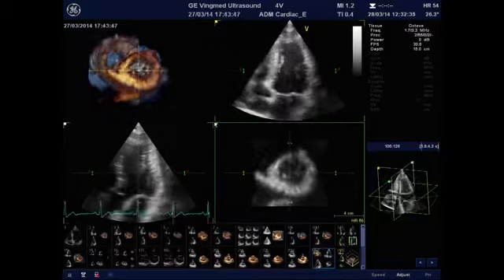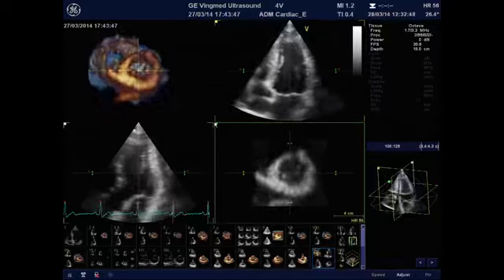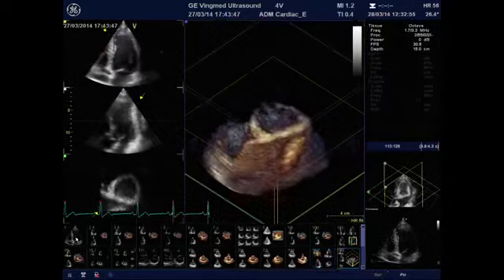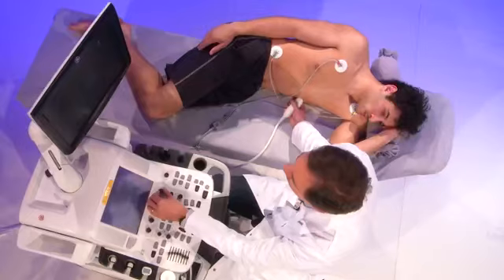So doing a complete examination with a full acquisition, you will also have the possibility to have directly all the cropping planes. So you have the coronal views, transversal views, and sagittal views in the same data set. And if you are a fan of this functionality, you can even use some cropping box and really look at the structures that are of interest for you.